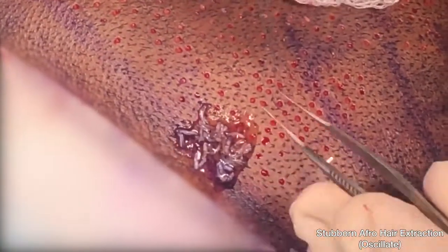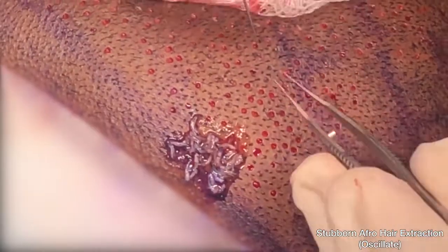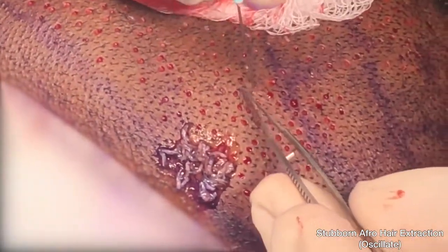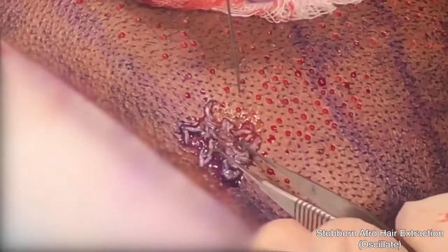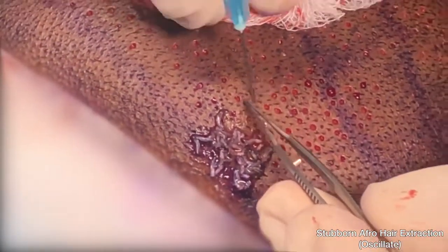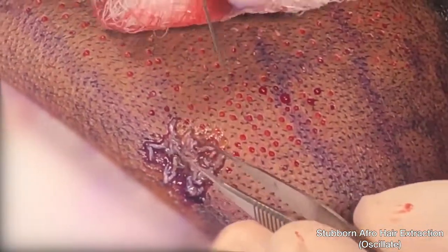Well, that's no longer the case. There is a system now that works for all African hair FUE. This system is the Dr. U Graft Revolution. It is a system that does all types of hair — African, Caucasian, Asian, straight hair, curly hair — with no exceptions.